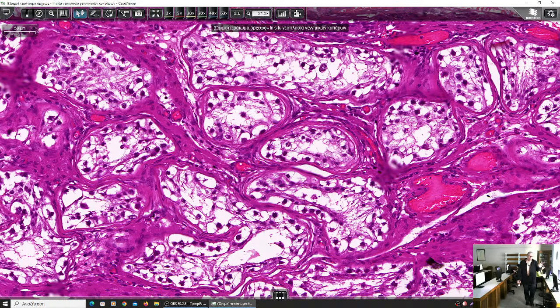An immature teratoma has malignant potential. As far as neuroepithelium is concerned, we have the counting of the neuroepithelial elements in an immature teratoma of the ovaries. This has nothing to do with the testes. A teratoma is always malignant in the testes of the adults. It's always malignant. That's right.